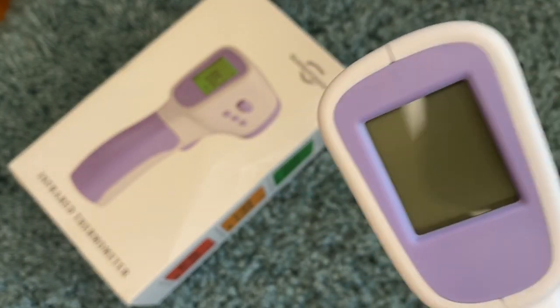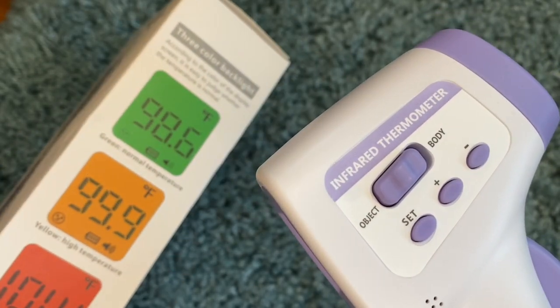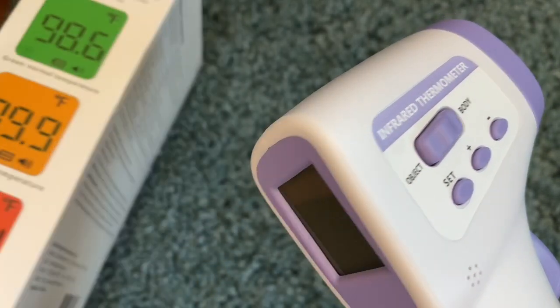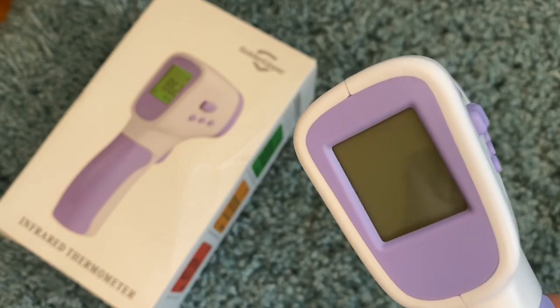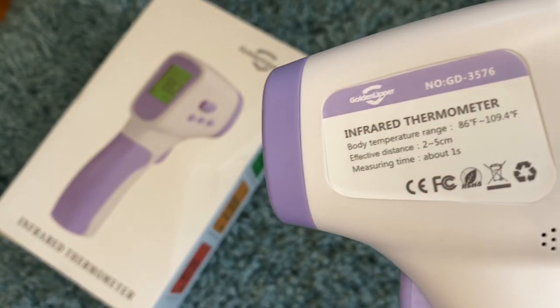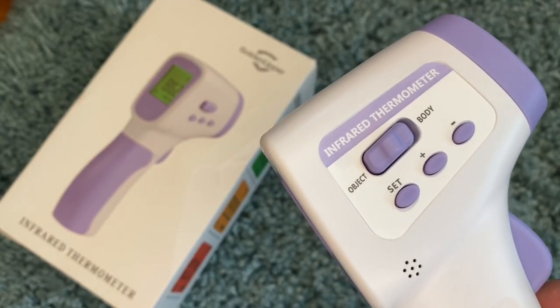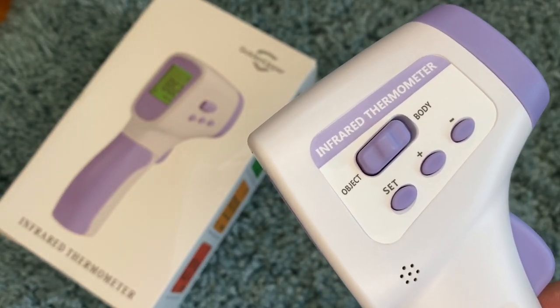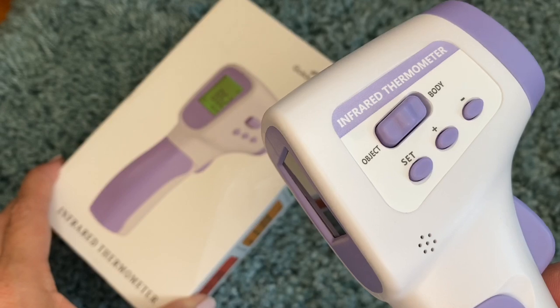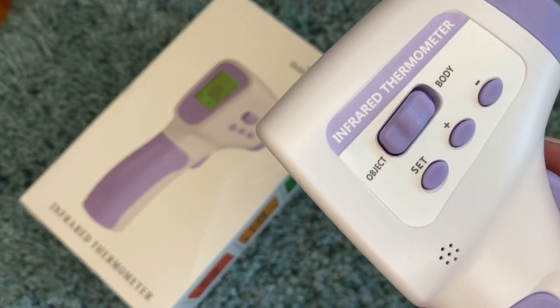The biggest problem with this thermometer is that it gets very bad reviews because it comes with little to no instructions. When you get this it will be set in celsius and it's almost impossible to figure out how to get it to fahrenheit, but I'm going to show you how. Once you do that, I think this is a really great little thermometer — super easy to use.